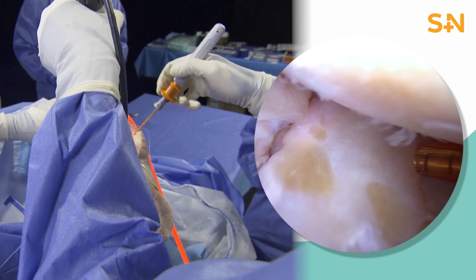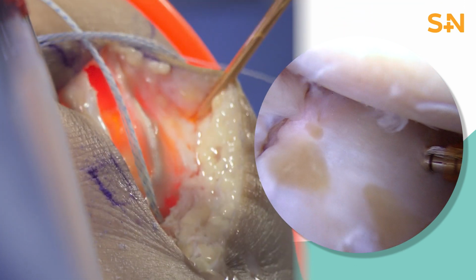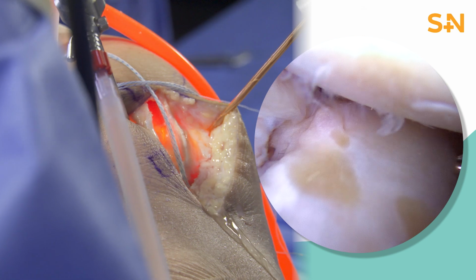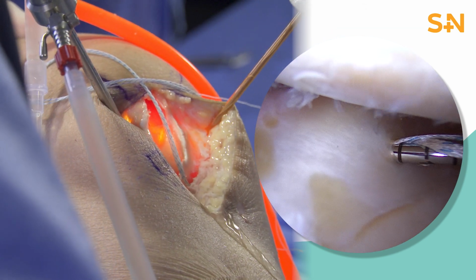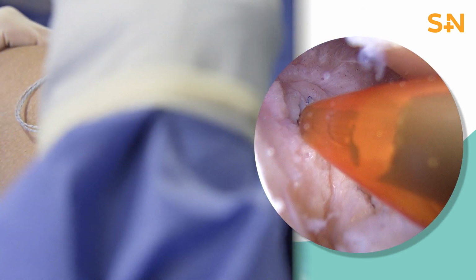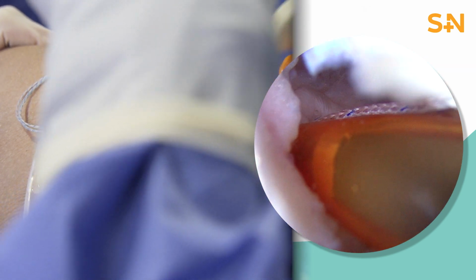After bending the implant to the optimal trajectory, the delivery needle is advanced until the depth penetration limiter contacts the surface of the meniscus. Proper deployment of the implant is confirmed by tactile, auditory, and visual feedback. Next, a second implant is deployed on the capsule for a vertical mattress configuration on the meniscocapsular junction.